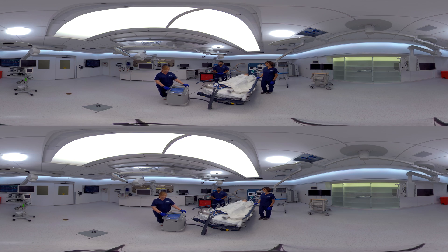Over time, you will see the clock start to count down on your cool patient box. Once it reaches zero, you will either get an alert or the Arctic Sun 5000 will automatically rewarm your patient back up to normal. On the lockout screen, you will see your target temperature, your patient temperature, your water temperature, and the trend indicator.